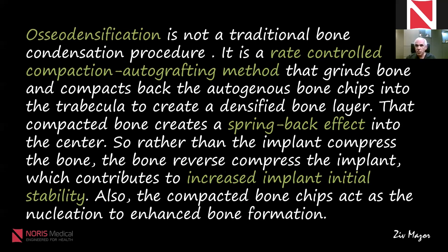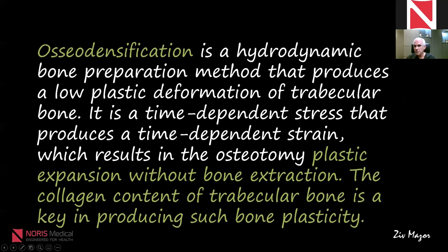And it is a hydrodynamic bone preparation. So if somebody says, I can do osseodensification without using water, he doesn't really know what he's talking about. And it is a plastic expansion without bone extraction. That means we are not taking any bone out. Everything stays within the osteotomy.